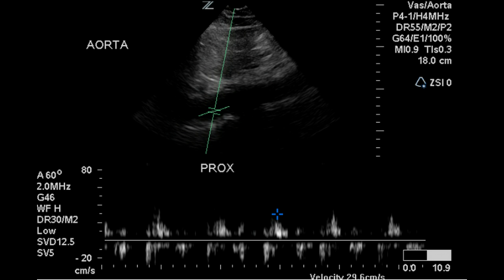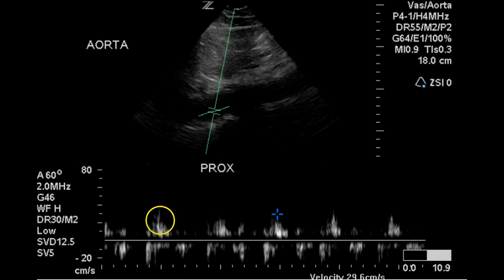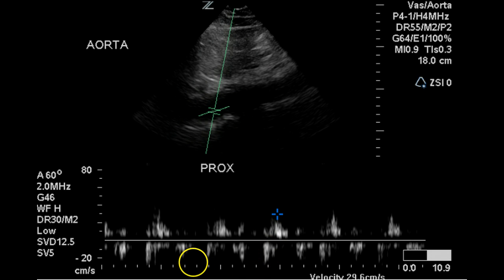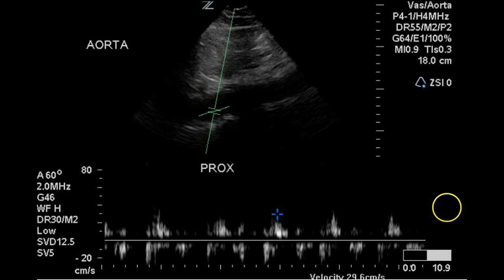Pulse Doppler indicates a rather diminished velocity of flow in the aorta. The flow is toward the transducer and thus is on top of the line. There is considerable turbulence and appears to be some reverse flow in a few areas, which is abnormal for the proximal aorta.